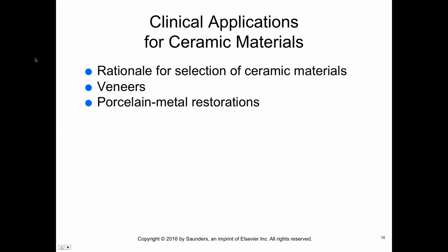They can be used for inlays, onlays, crowns, and veneers. The major drawback of all ceramic restorations is their potential to fracture. Advances in technology over the past 3 decades have led to the development of sophisticated computer-assisted design and computer-assisted machining for general industry and for dental applications.